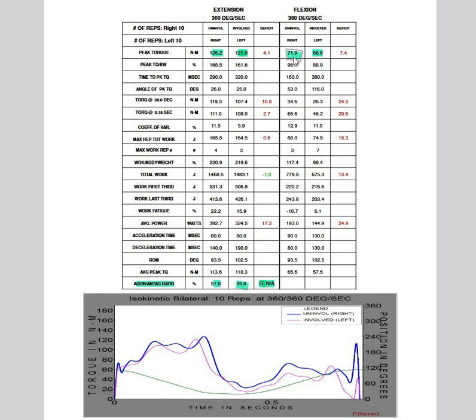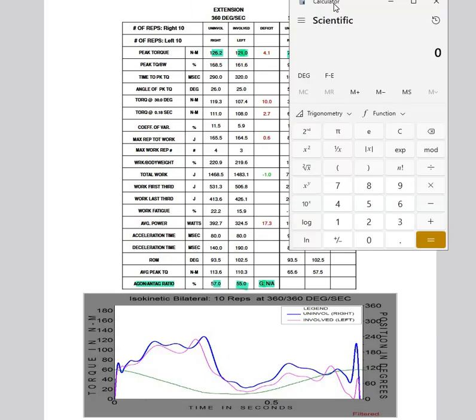An alternative to this, which you could do, and I will end this video very soon, I appreciate this has been quite a long video, is that you could also create your own HQ ratio quite easily by performing an average HQ ratio assessment. In the same way that we looked at peak torque and average peak torque, to the best of my knowledge, I don't believe there is much research out there about average HQ ratios, but certainly something to look into.